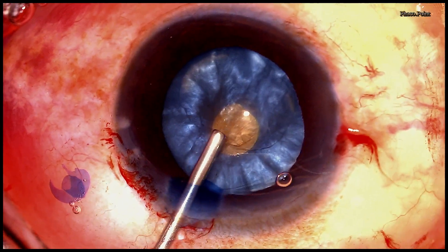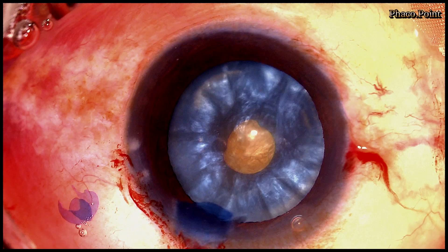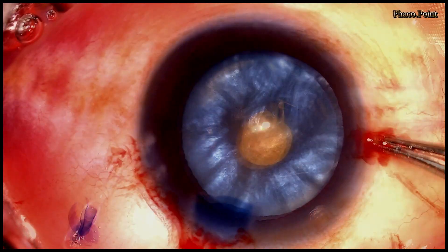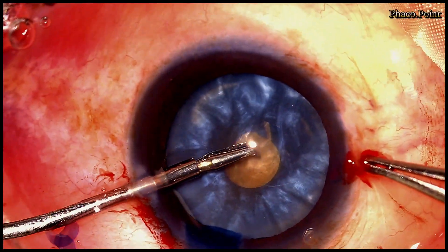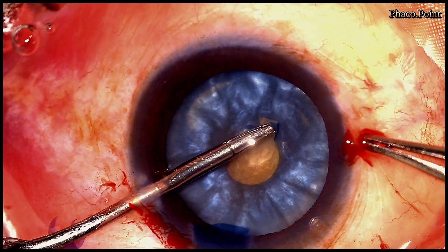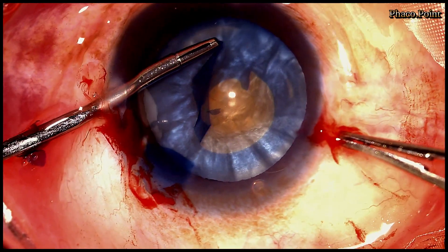Once more, some dispersive viscoelastic is introduced into the anterior chamber to flatten the anterior capsule. The cystitome is reintroduced and after making a tear in the anterior capsular edge, an intraocular forceps is reintroduced into the anterior chamber, holds onto one edge of the tear, and proceeds to enlarge this opening into a suitably sized larger rhexis.